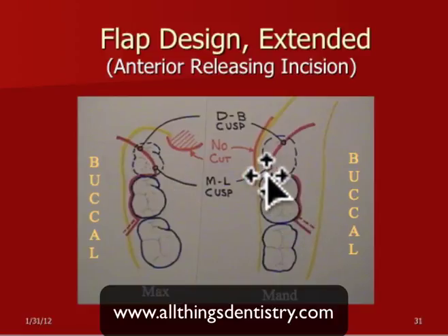And then I come out of a semicircular cut like this out toward the buccal. Now, it goes through the mesio-lingual cusp, right over the central fossa and over the distal buccal cusp like that. There's 2 no-cut zones here on the lingual side because of the lingual nerve, and also here you have the greater and lesser palatine foramens and their arteries and nerves coming forward. So you want to stay away from these areas.